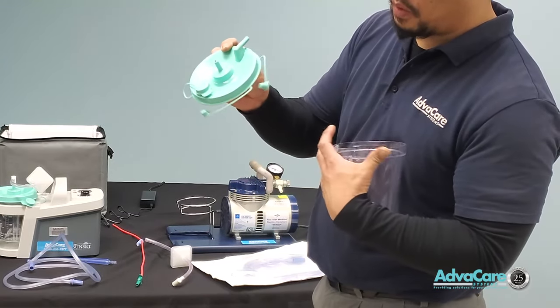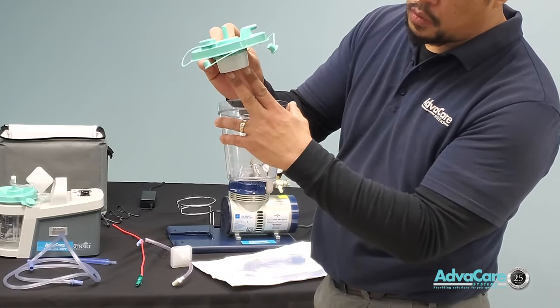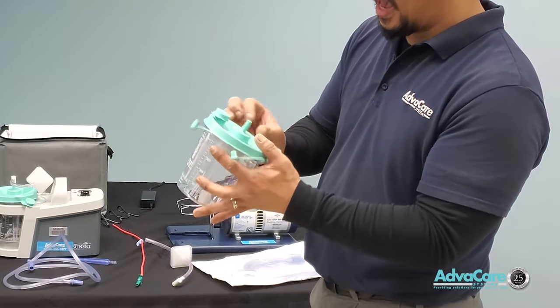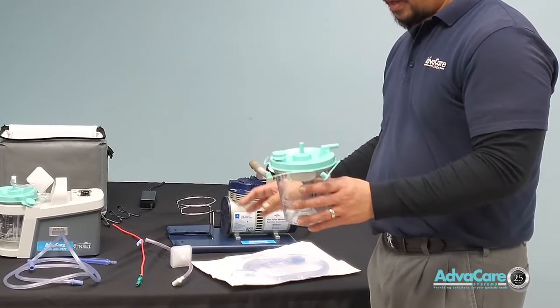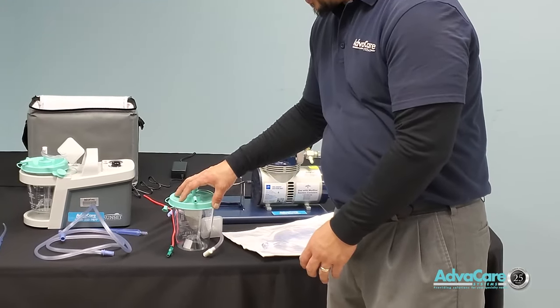When you take the canister cap off, you have an overflow stop protection float at the bottom of the canister cap. The float will rise if the fluid becomes too full, to prevent fluid from passing the point of the canister and entering the device.